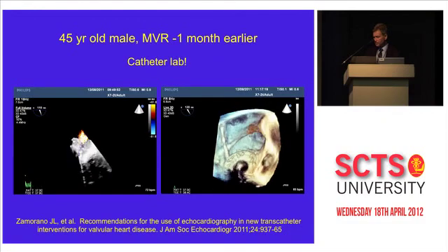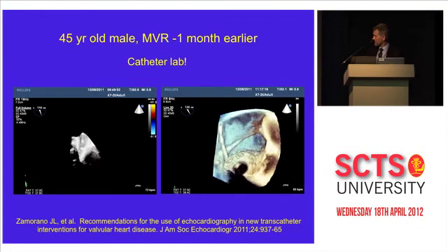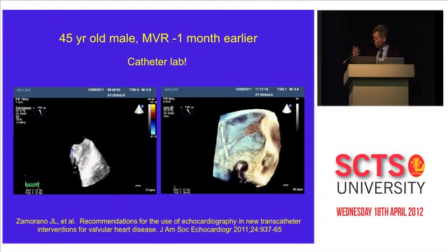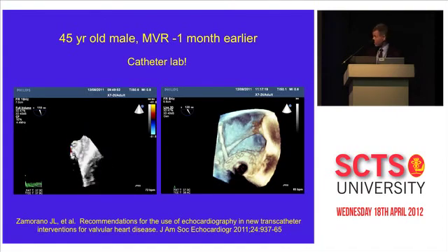And just to demonstrate with our 3D echo, we can see the catheters they put in, and then they nowadays absolutely love to close it off with these Amplatzer devices. And this is something that you see more and more happening. And yes, it is very good. It saves a critically ill or a sort of frail patient a second operation.